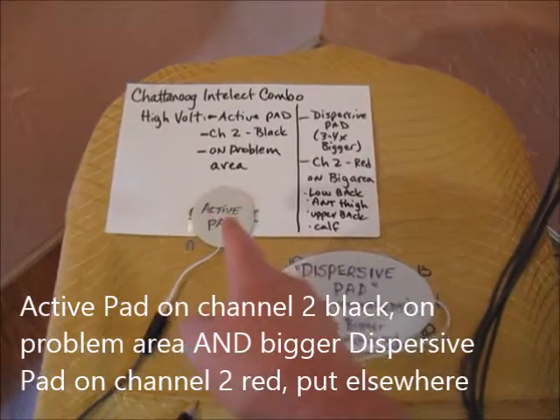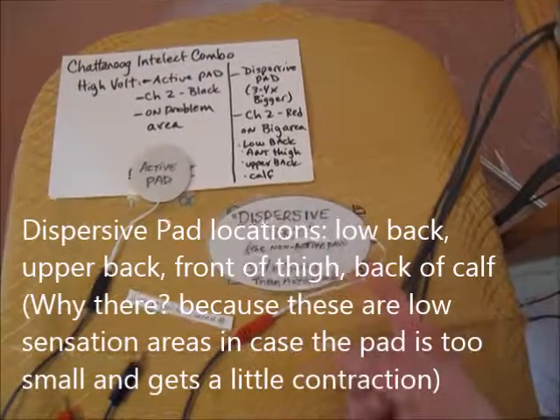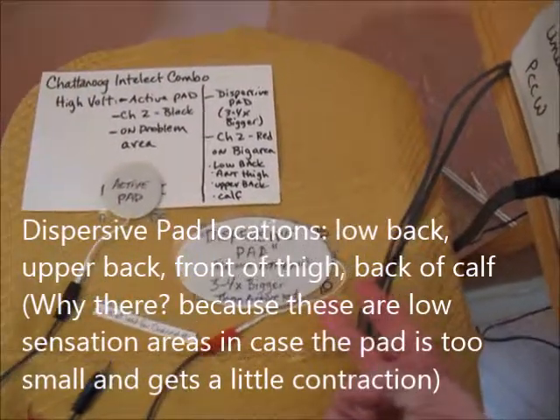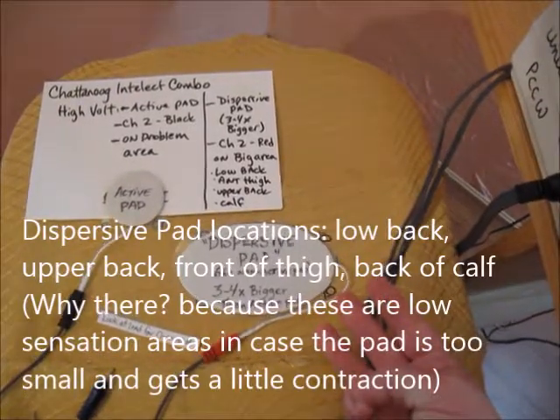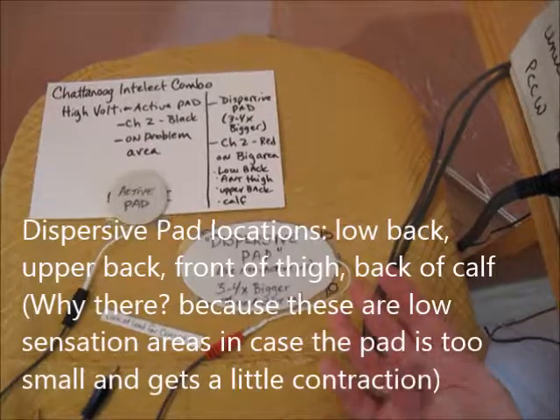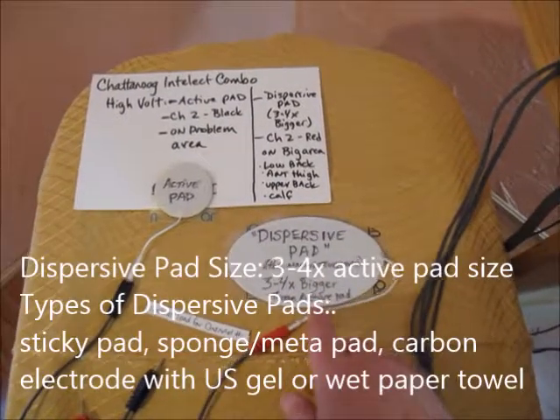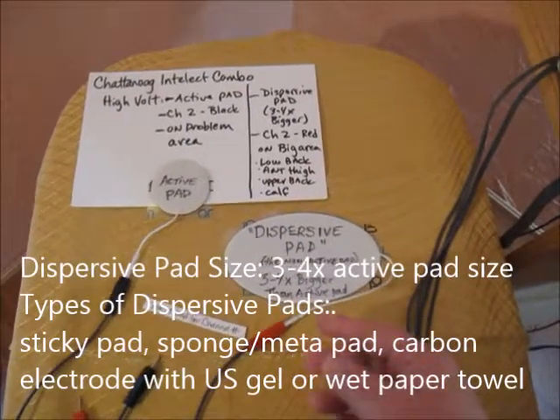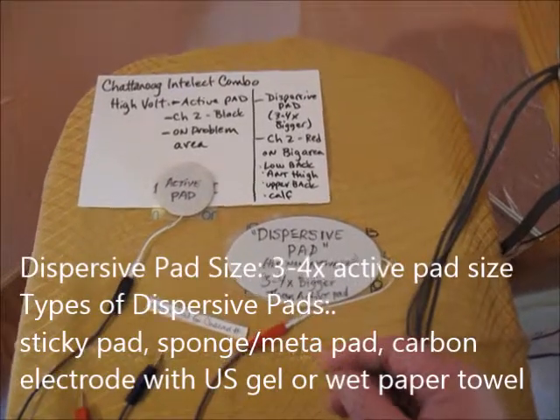The active pad will be put on the problem, the dispersive pad will be put somewhere big, like low back, back of shoulder near the traps and scap area, on the front part of the thigh, or in the back of the calf. Why those 4 areas? Because they have low sensation. The dispersive pad should be 3 to 4 times the size. It could be a sticky pad like this, or a sponge and a metal pad, or one of those carbon electrodes with ultrasound gel or a wet paper towel.